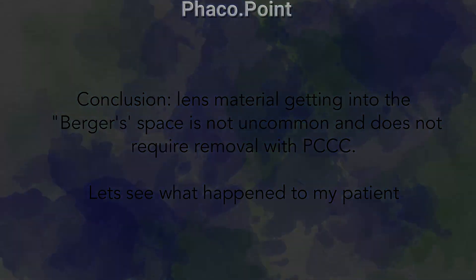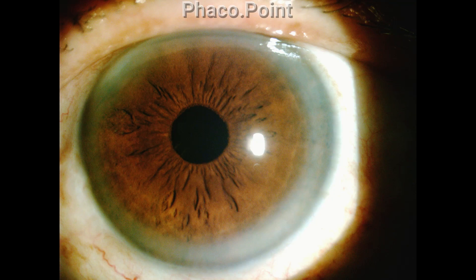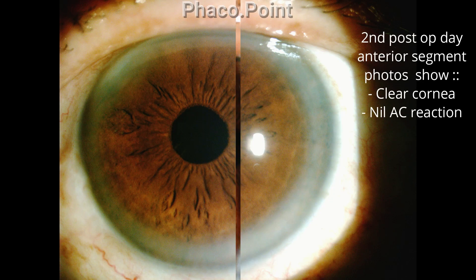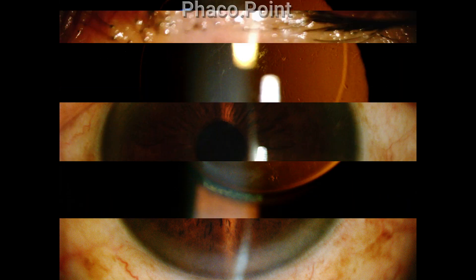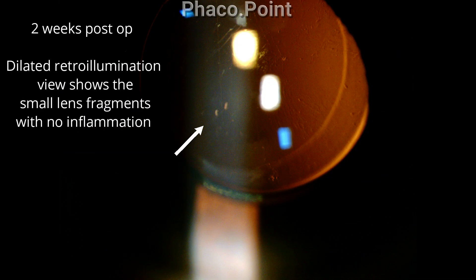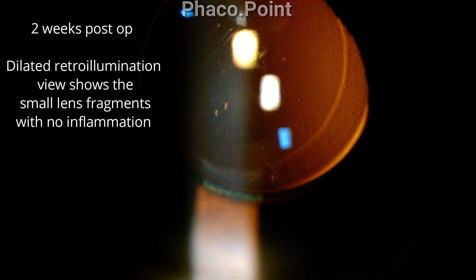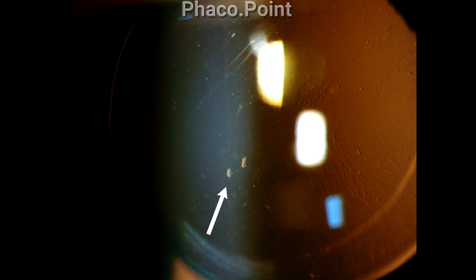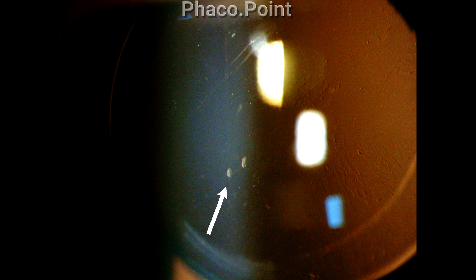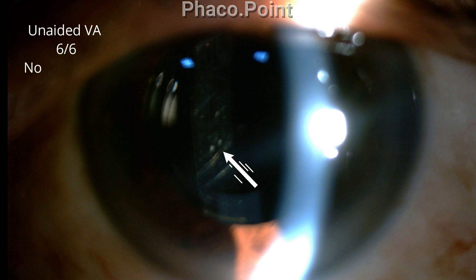Let's see what happened to my patient. On the second post-operative day, the cornea was crystal clear, there was no sign of inflammation in the anterior chamber, and the eye was very quiet. When we followed this patient up after two weeks, under a retro-illumination view the small lens fragments could be seen, but there was no sign of inflammation. These small lens matter fragments get trapped in the Berger space and are completely excluded from the inflammatory mechanisms of the eye — they do not contact the iris nor the vitreous, and therefore will not incite an inflammatory reaction.